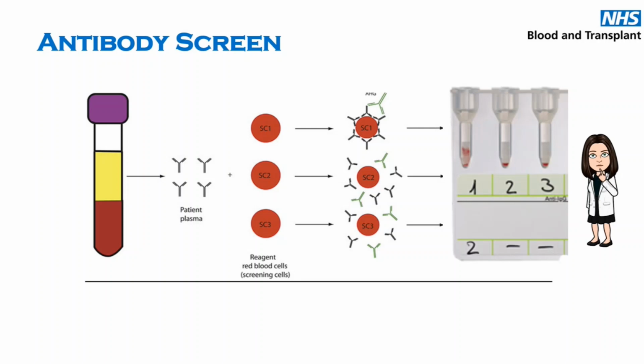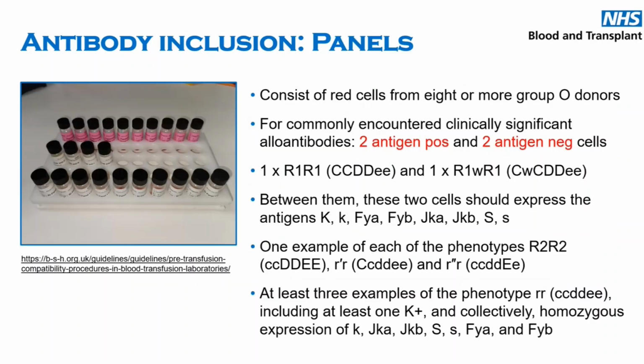So great, you've got a positive antibody screen, but what does it mean? It doesn't really tell you specifically what's going on. So this is when you want to do your antibody panels. These are much more specific and will give you a good idea of what's going on.